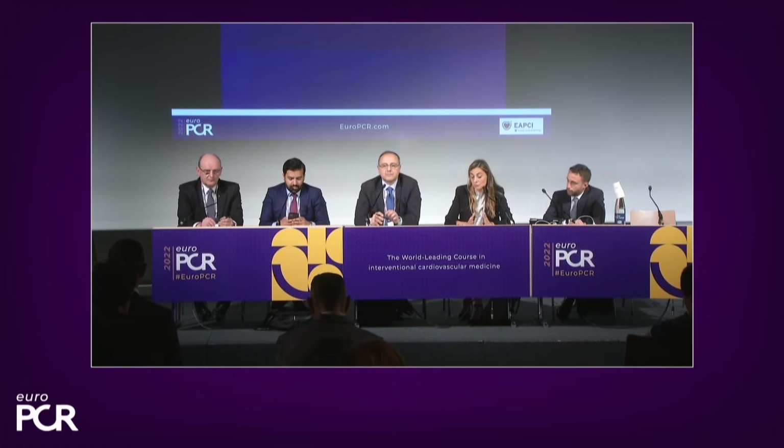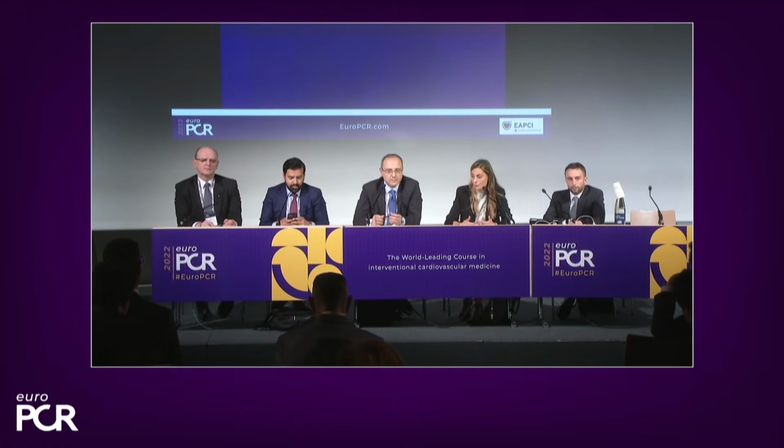I prepare the lesion with a different kind of balloon, really remaining at low pressure, and then drug-eluting balloon can be also used in a final kissing inflation, because in this way you can restore the anatomy and the architecture of the bifurcation, but you always have to complete this procedure with a final POT, as we know also from the EBC trial.